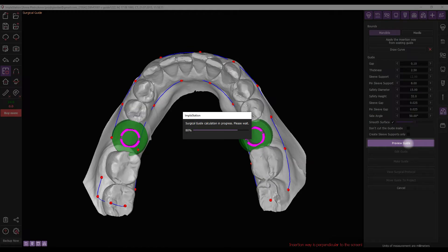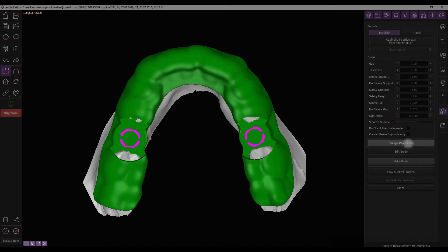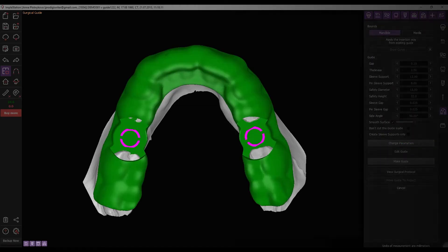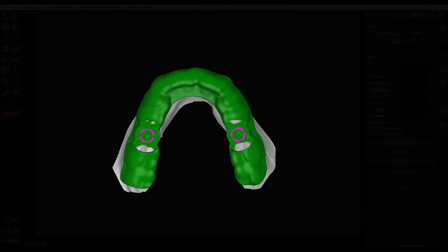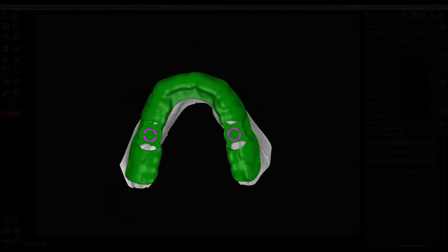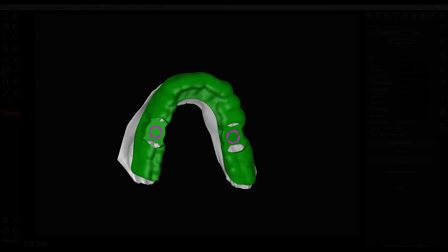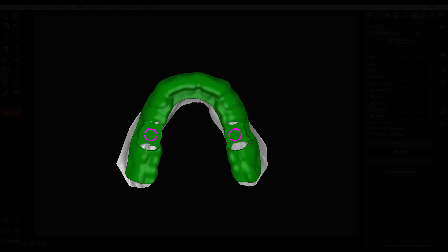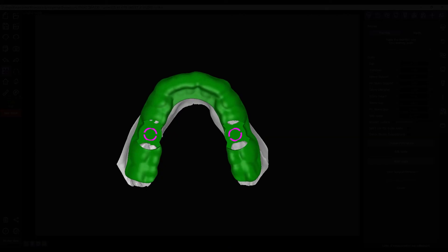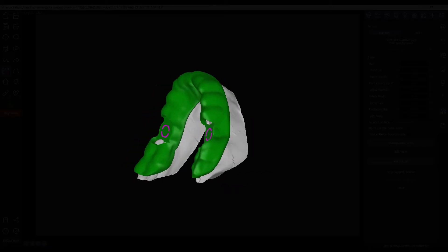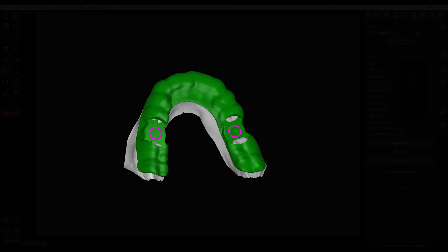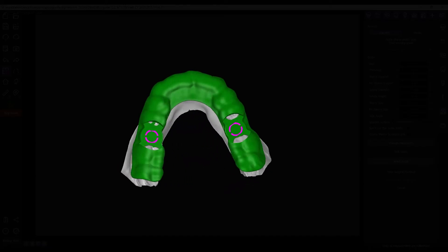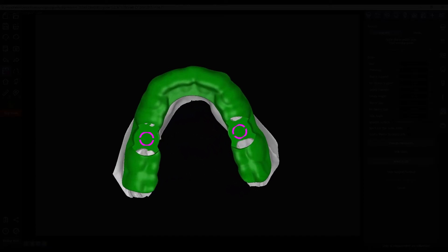At this step, you can review the shape of the guide before finalizing its creation. Don't worry if it seems incomplete, such as if some holes haven't been cut yet. The full guide model with all elements will be previewed in the next stage, so assessing the guide's shape for now is important.